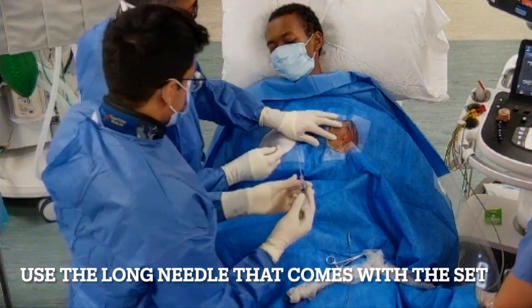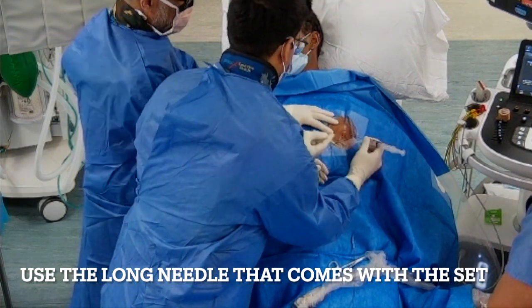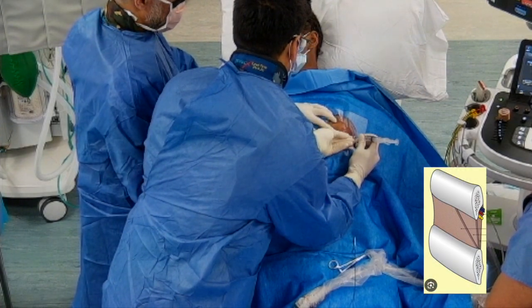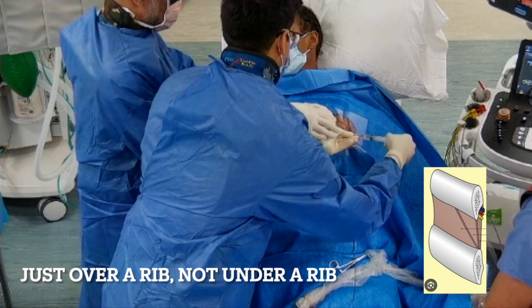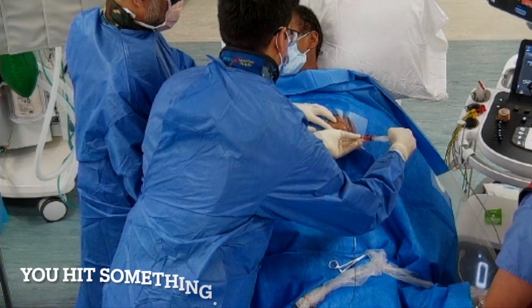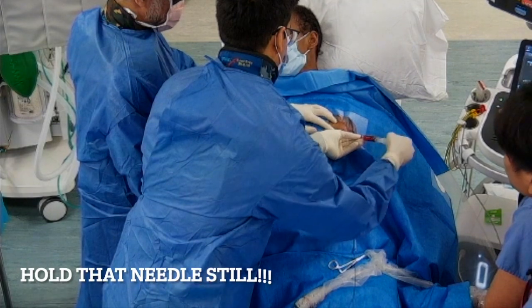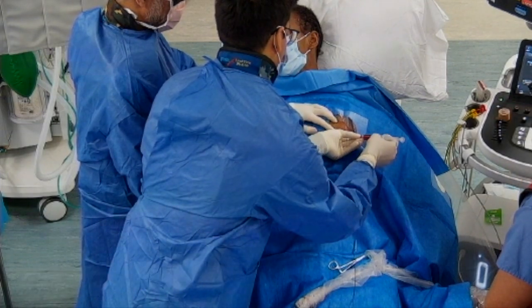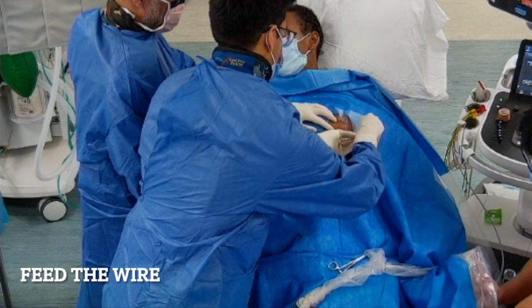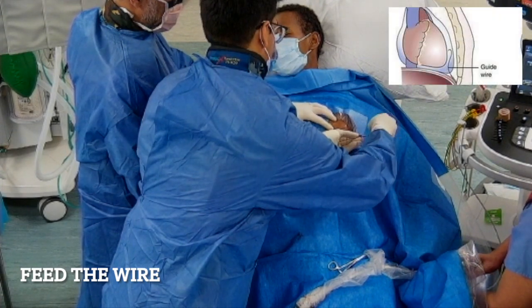Once we've infiltrated the skin, sometimes a green needle is enough to reach the fluid, but sometimes we need the longer needle that comes with the set — I always use an 8 French set rather than a 6 French. We advance slowly, going just above the rib with no jerky movements. We then see some red fluid coming back. Red pericardial fluid indicates either infection or cancer; the concern would be pulsatile red blood meaning the left ventricle has been punctured. As long as it's just the needle and the tract hasn't been dilated, you can usually get away with it.